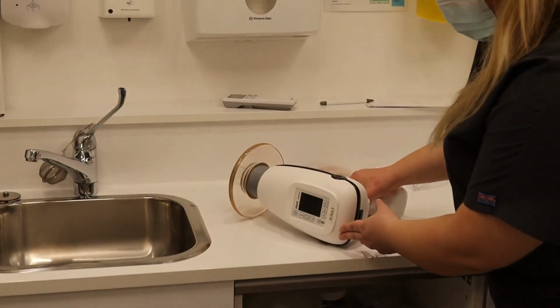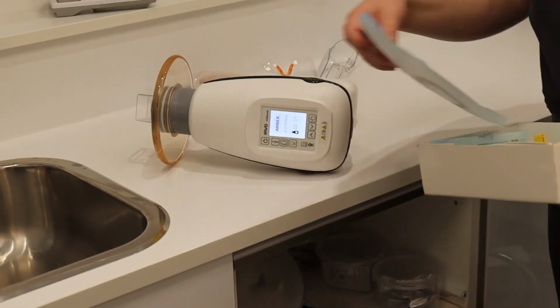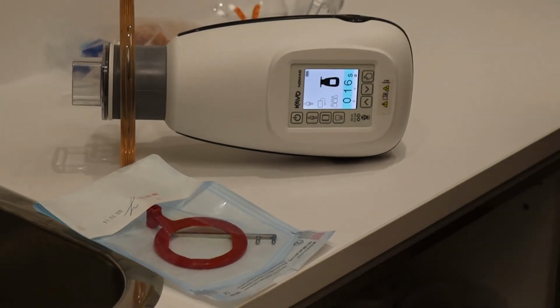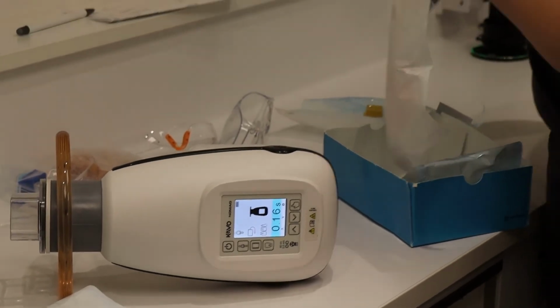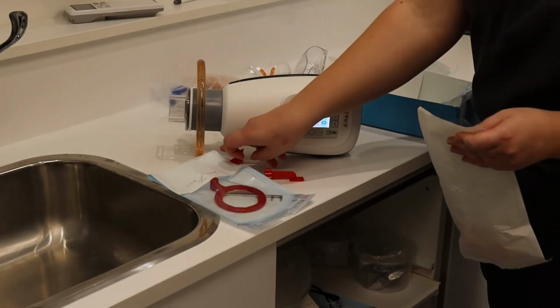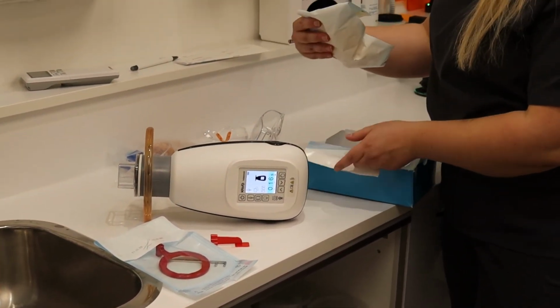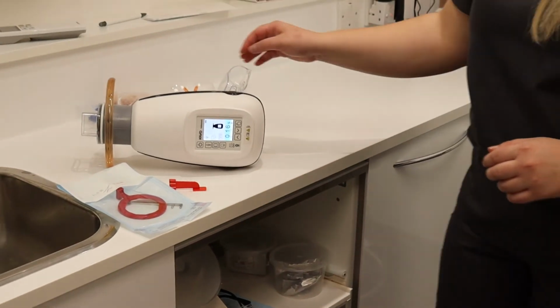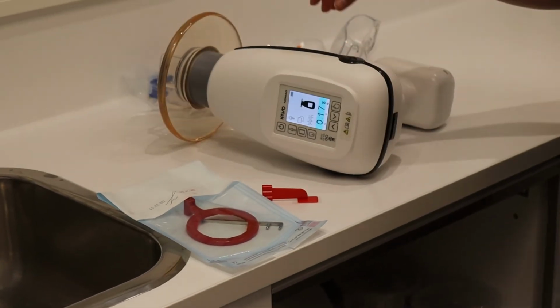It's important as a dental nurse to anticipate, during the appointment or before the appointment, when the dental X-ray is going to be required. You need to set up the Nomad 2 and check, the first thing is turn it on and then check that there's sufficient battery. You should always be checking the battery level to make sure that the dentist has battery to take X-rays during the day. It does take a long time for the battery to charge, so if you run out, it can be a problem. The nurse will then set up the sensor using a targeting device.